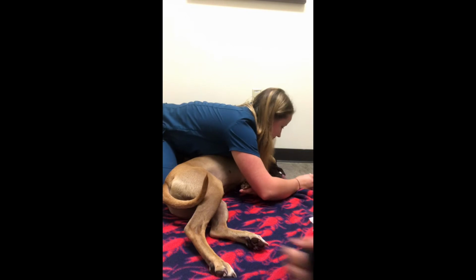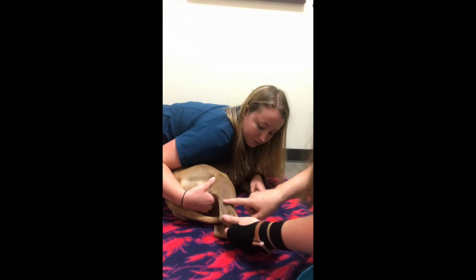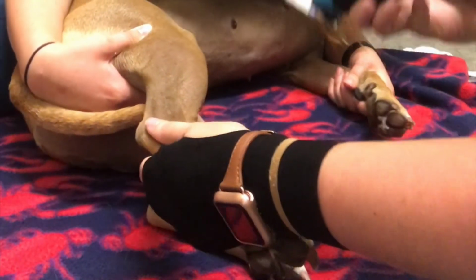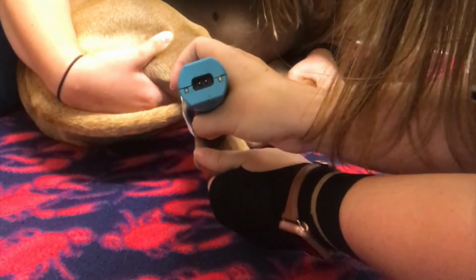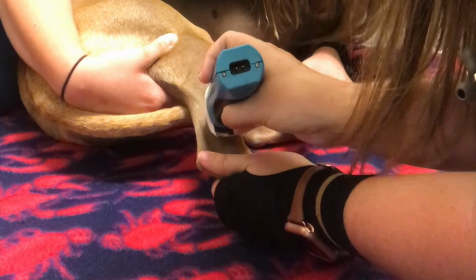I'm just going to clip some area around her vein here on her saphenous vein. And this patient has very short hair, so there's not going to be too much hair that we can clip, but we'll try to get as much as we can.